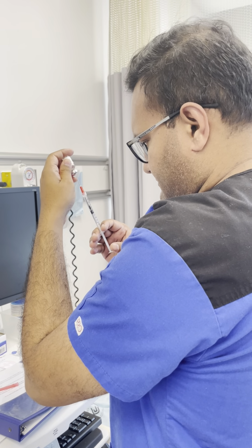And making sure to keep on my medication label so that in case any discrepancies happen, I'll always know what is on the medication. And then as you see here, it is the calories.